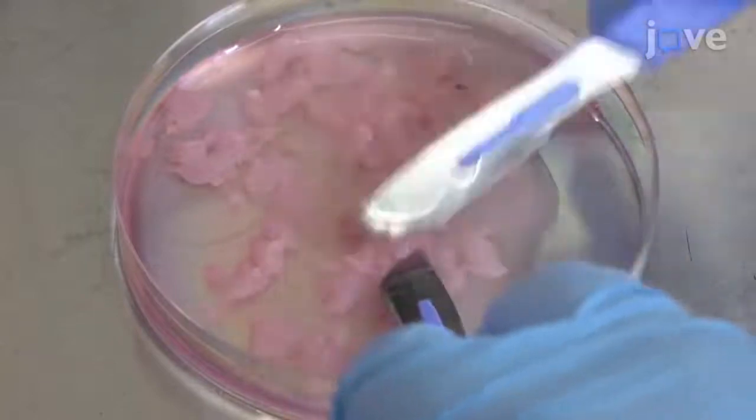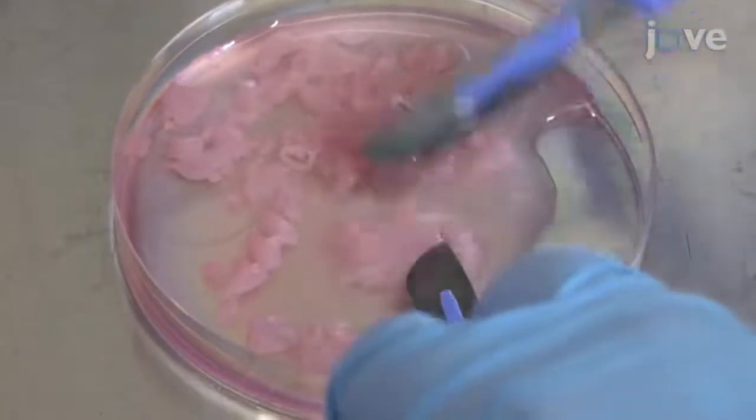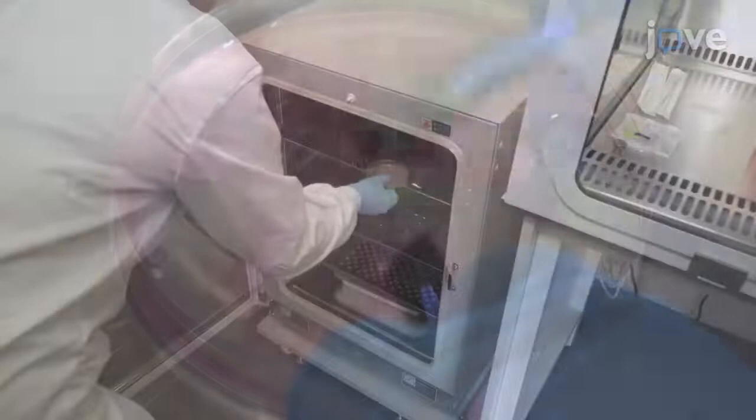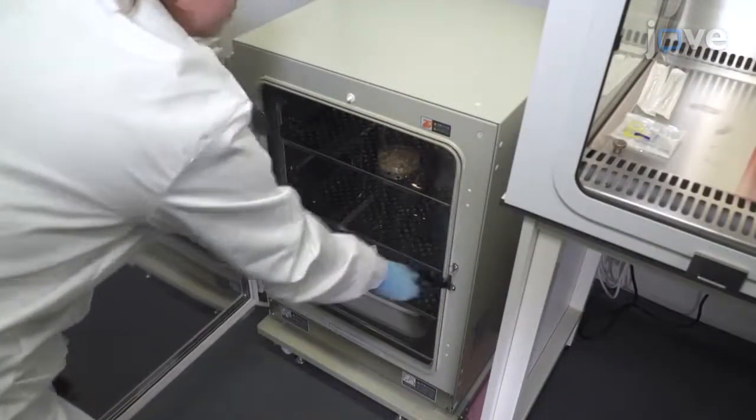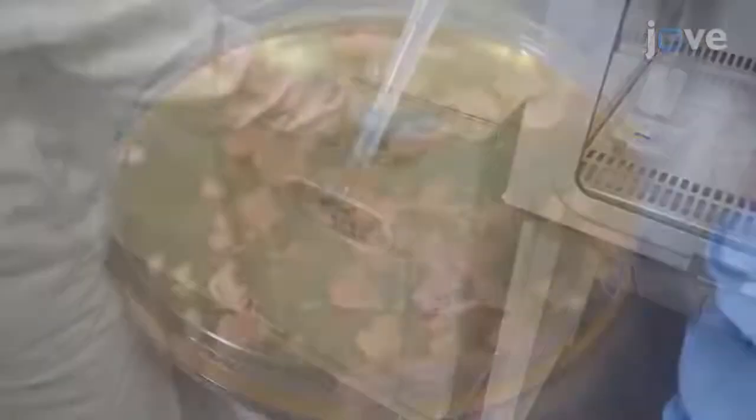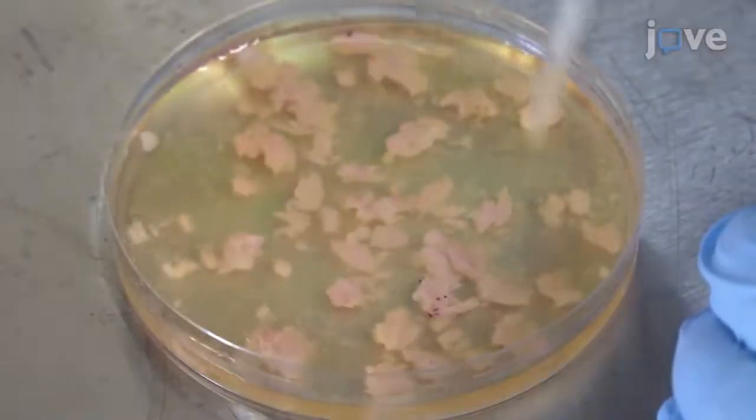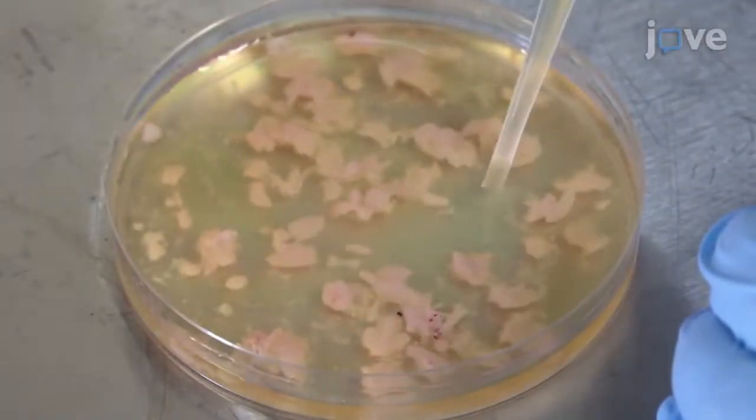Use sterile scissors or a scalpel blade to cut the BF into pieces that are less than five millimeters in diameter. Incubate at 37 degrees Celsius with periodic gentle agitation for 30 minutes.